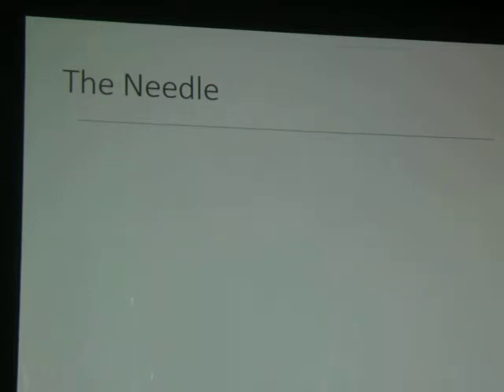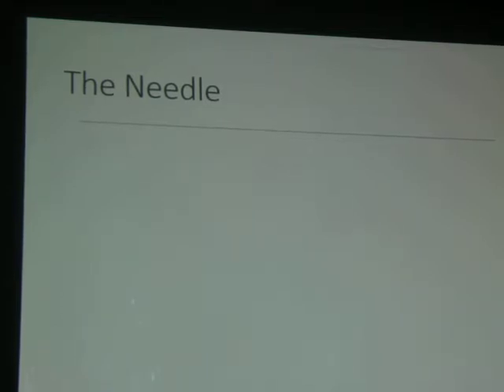اتكلمنا على الخيط، بس الخيط لوحده ملوش أي قيمة. I cannot introduce my suture material without a needle. للأسف الشديد التيشوز عندنا مش متخرمة زي الجزمة كده هندخلها جوه العيون. We have to put the suture through the tissue with a needle. Again, نسمع كلام كتير قوي عن needles. هاتيلي إبرة راوند، هاتيلي إبرة قطعة.